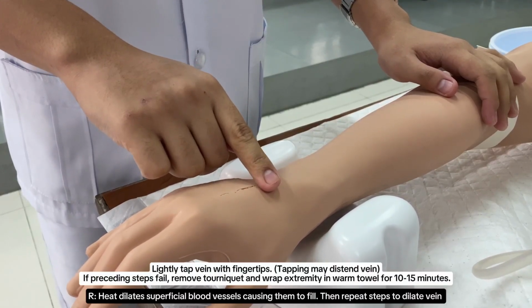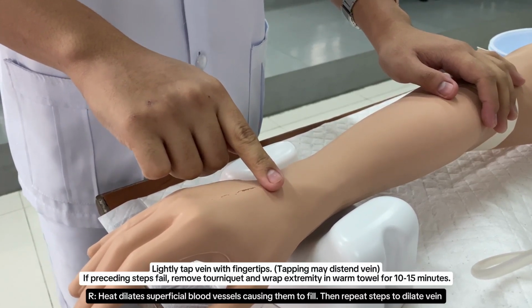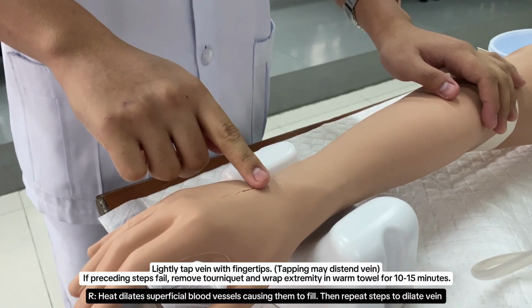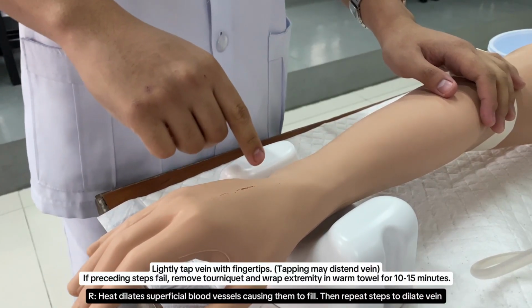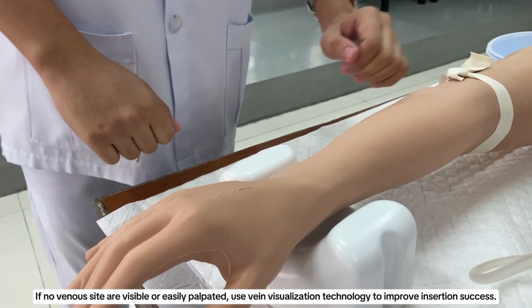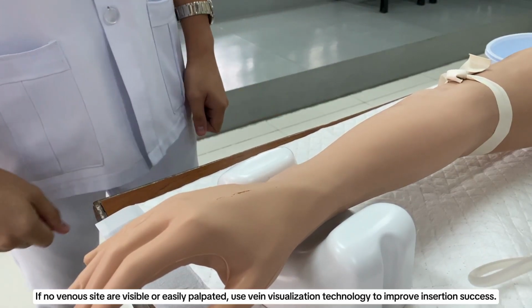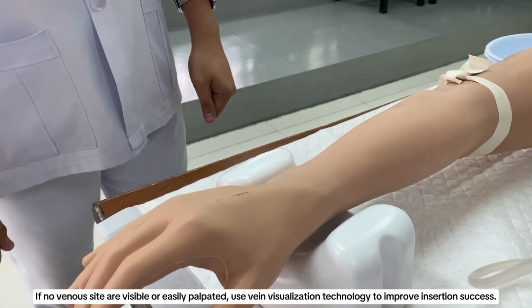If the preceding steps fail, remove the tourniquet and wrap the extremity in a warm towel for 10 to 15 minutes. Heat dilates superficial blood vessels, causing them to fill. Then repeat the steps to dilate the vein. If there is no venous site visible or easily palpated, use vein visualization technology to improve insertion success.